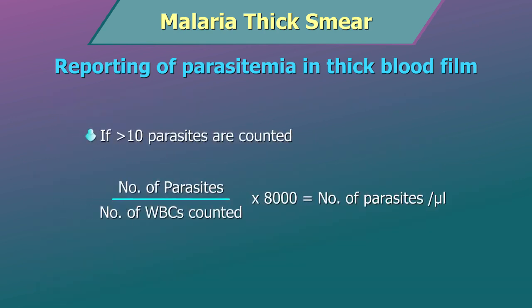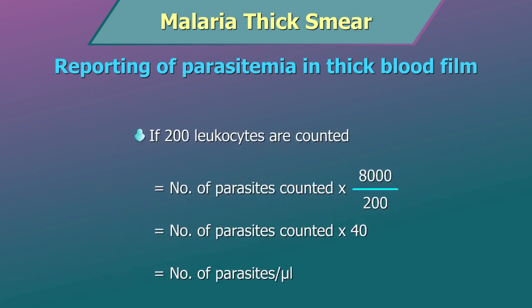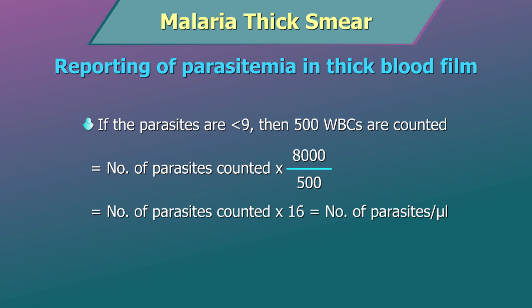If more than 10 parasites are counted, then the following formulae can be applied. Number of parasites divided by number of WBCs counted multiplied by 8,000 gives us the number of parasites per microliter of blood. Or, if 200 leukocytes are counted, number of parasites counted multiplied by 40 gives us number of parasites per microliter of blood. If the parasites are less than 9, then 500 WBCs should be counted, and the formula will be number of parasites counted multiplied by 16 will give us number of parasites per microliter of blood.